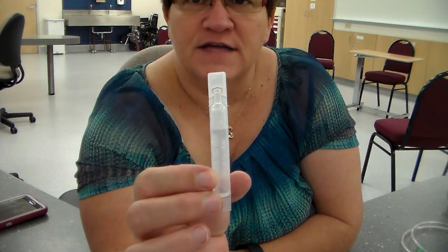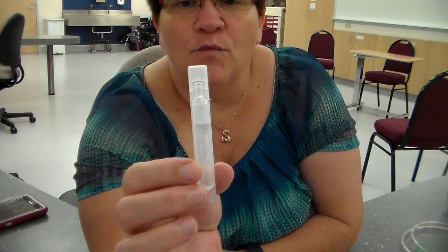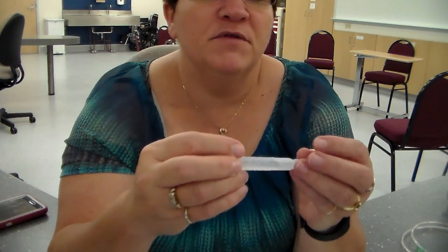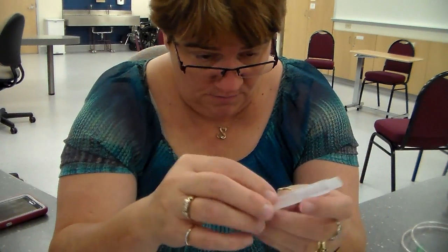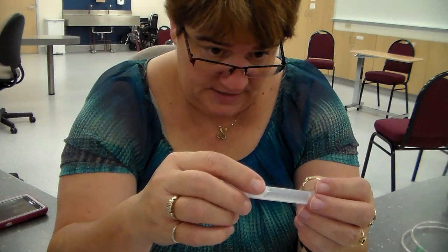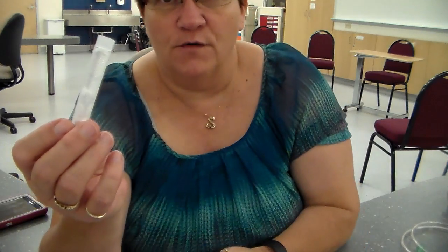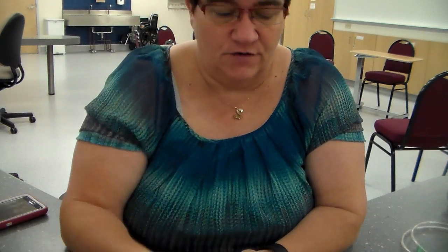You're going to prepare the correct amount of medication without contaminating it. Most of your nebulizers are going to come in single dose vials, ampules, whatever you want to call these. Usually it's just one of them, and I believe that this one is albuterol sulfate inhalation solution, and it's 2.5 milligrams per 3 milliliters. So this is a 2.5 milligram dose. That's pretty standard.